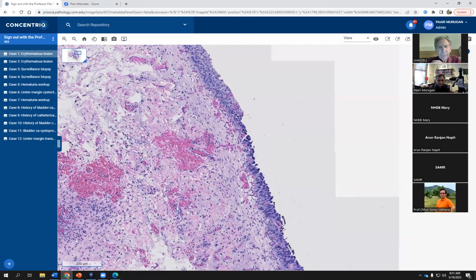Not in that context of P53 mutation, but you bring up a really good point, and I'm glad you caught on to that. The second example that I showed you in that PowerPoint was actually a null pattern of P53. It's uncommon. As you know, you see it in female genital tract and uterine malignancies as well, the null pattern of P53 in serous carcinomas and ovarian carcinomas.